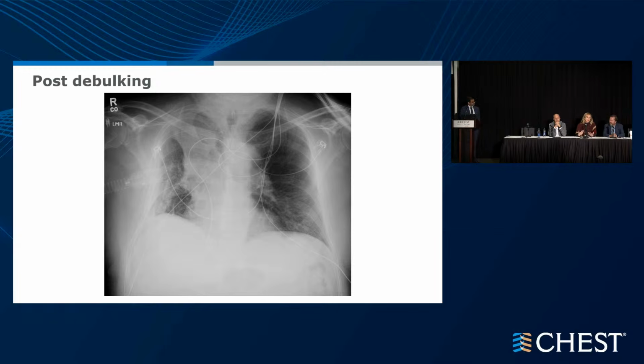avoiding the stent is always ideal. I would only consider a stent, and especially on the right side, it would be a partially covered stent. It depends on where the location of the pathology is. I wouldn't want to potentially jail off permanently the right upper lobe, so you want to have an output, a throughput for secretions and aeration in if you needed to. But in this case, I'd probably just do a local, pretty assertive debulking to maintain that main stem and the bronchus intermedius, get the patient to systemic therapy, and then have close interval follow-up and forgo the stenting.